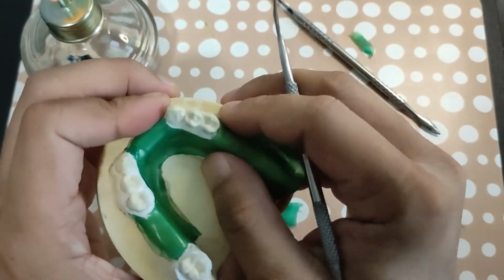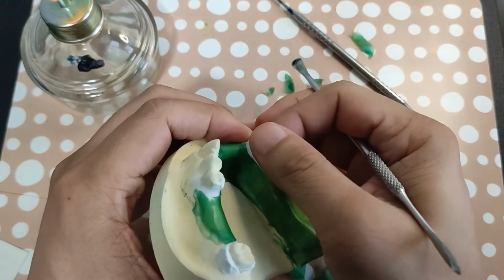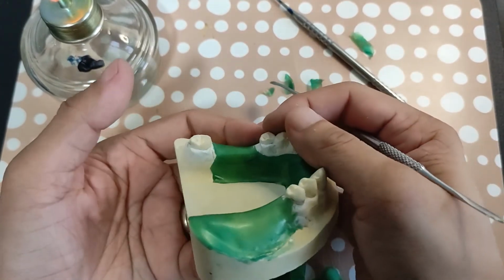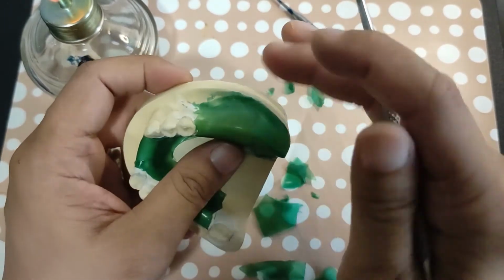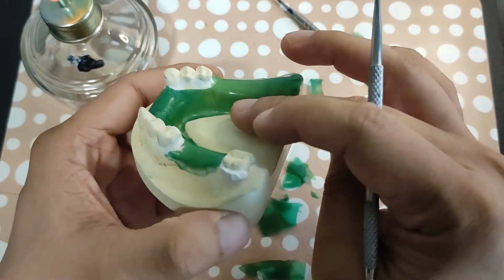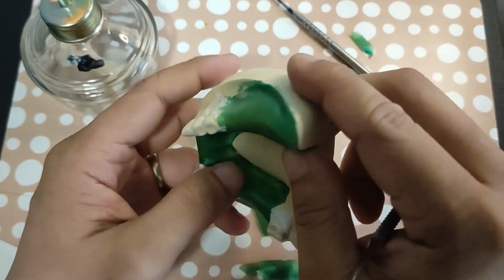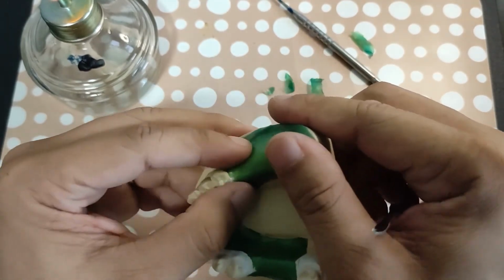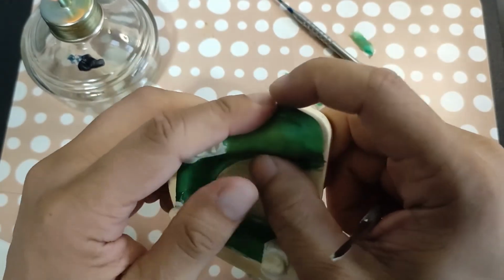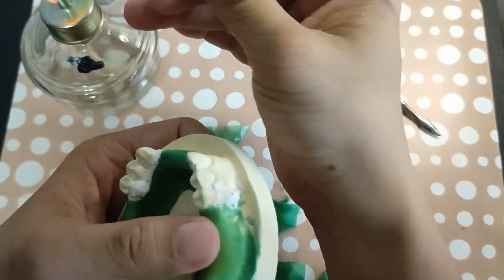The only thing that I'm concerned with is that are the teeth or the crowns visible? Hindi ba siya covered ng wax? Hindi naman, di ba? So even if it extends past the buccal, that's fine. If it extends past on the lingual into the sulcus and into this area right here, that's also fine, right? The purpose of the relief or the green wax is to provide relief. It doesn't necessarily have to follow the form of your major connector, so that's no problem with that.